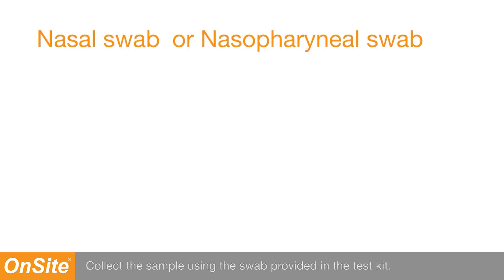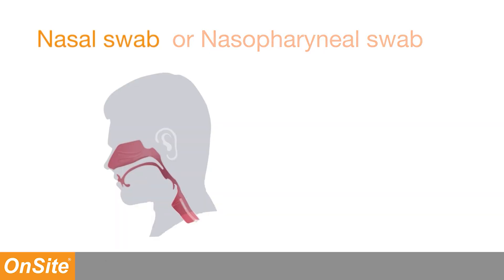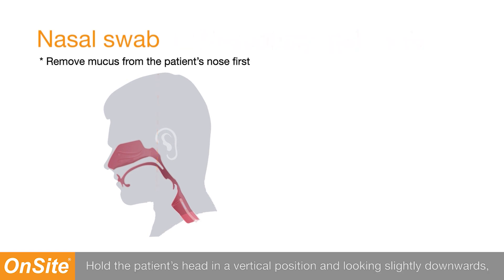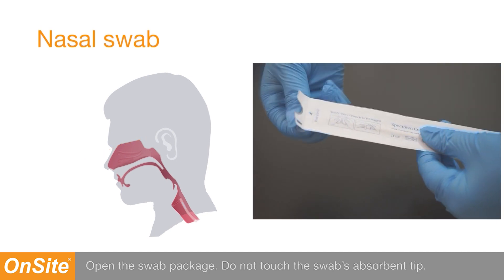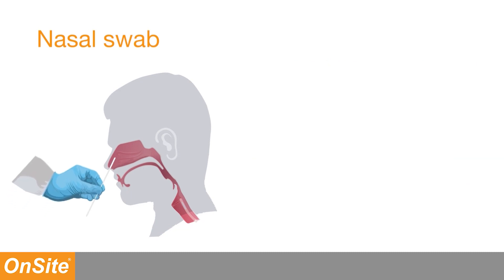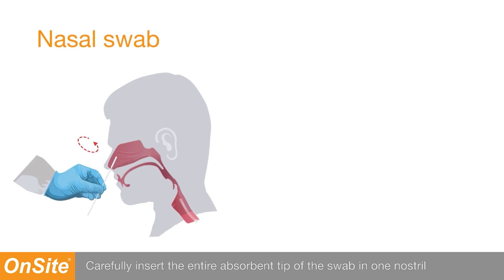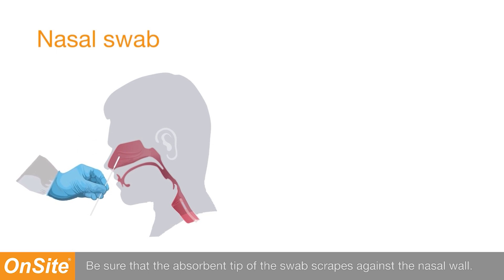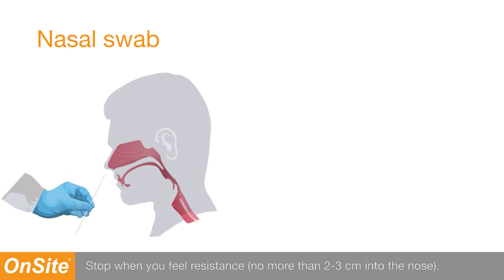Collect the sample using the swab provided in the test kit. To collect nasal swab specimens, hold the patient's head in a vertical position and looking slightly downwards. Open the swab package. Do not touch the swab's absorbent tip. Carefully insert the entire absorbent tip of the swab in one nostril and rotate at least five times. Be sure that the absorbent tip of the swab scrapes against the nasal wall. Stop when you feel resistance, no more than two to three centimeters into the nose.